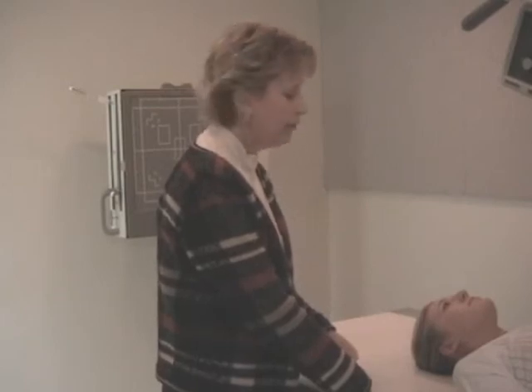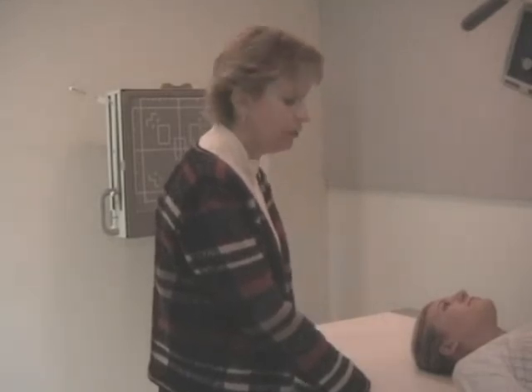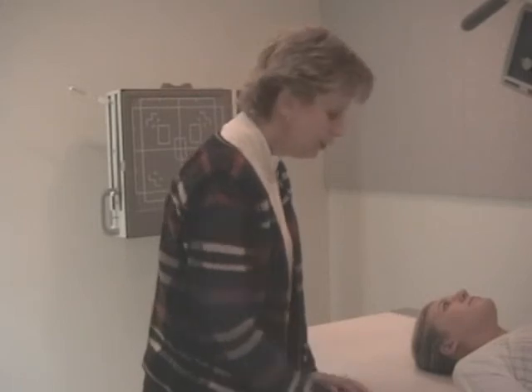You could actually continue the cervical spine series at the vertical board, but for demonstration purposes and better camera angles, we've converted the patient to the recumbent position. And your vertical boards may or may not allow the flexibility of continuing the series in that way. So seeing this on the table is beneficial too. And you can decide, again, like we said, anything you do vertical, you can do recumbent or vice versa. So we're going to look at our patient now.